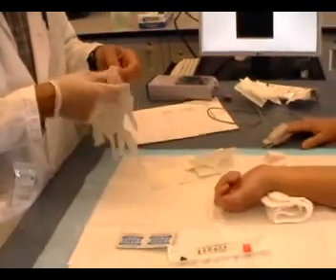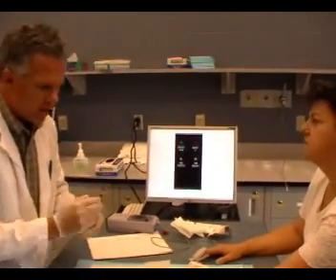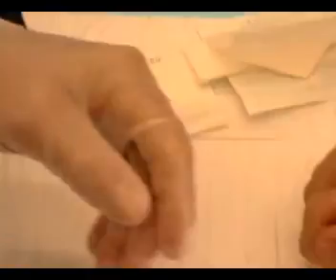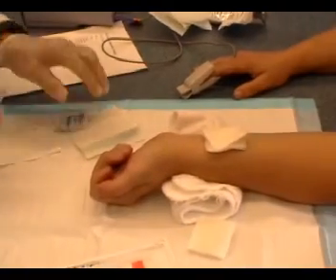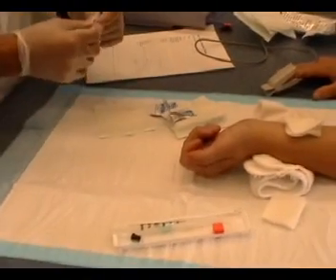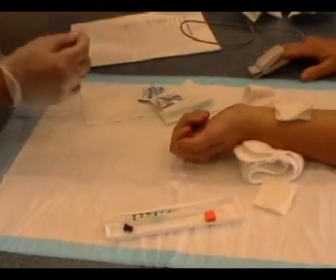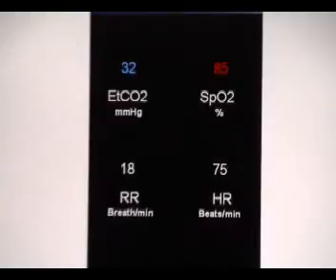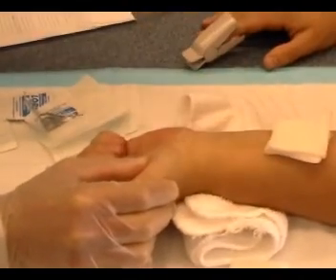When you did it before, was there any complications? Did you have any bruising? It hurt. Just hurt? Yeah, it really hurts. I'm going to put a little bit of cold alcohol here just to cleanse the site. I noticed you seem to be a little bit nervous — your heart rate's come up a little bit. I don't like these. I don't blame you.